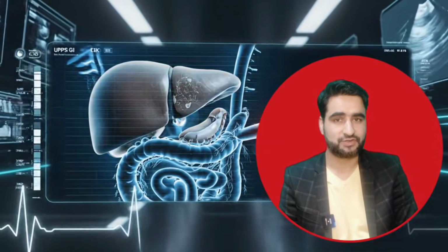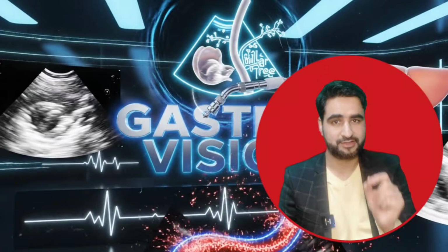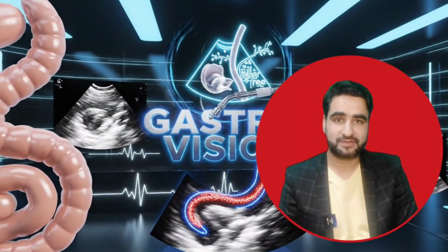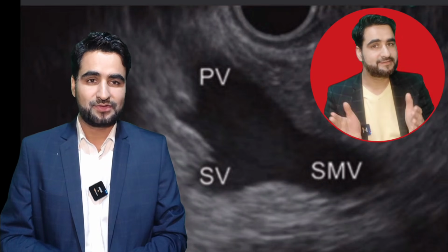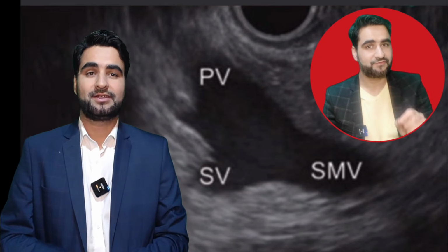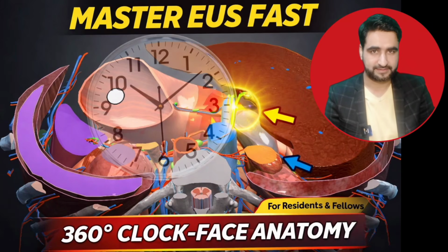In my previous video on duodenal bulb orientation, I explained how clockwise and anti-clockwise rotation of the echoendoscope affects the ultrasound image you see on the screen. I demonstrated exactly why the probe is positioned as it is when entering the duodenal bulb and clarified why specific structures appear with rotational movements. That foundation is essential for understanding today's topic.